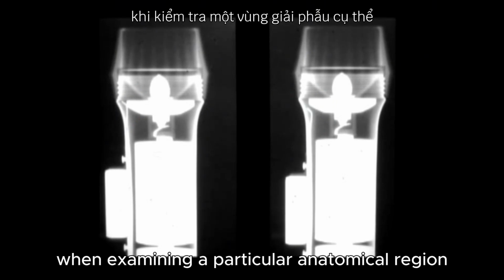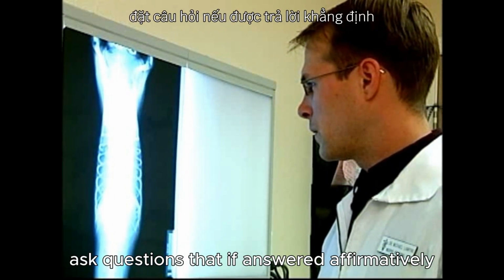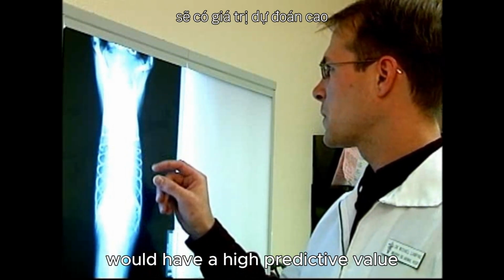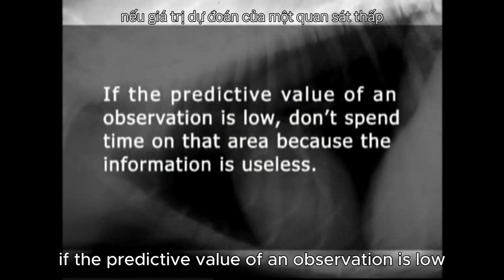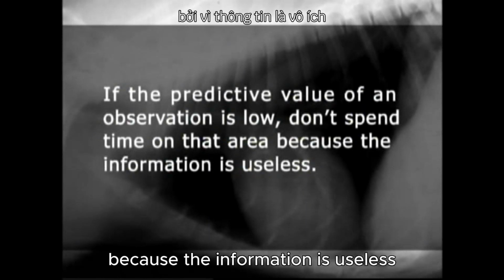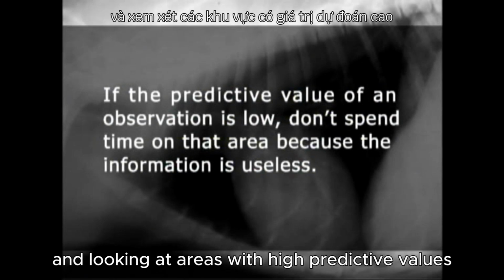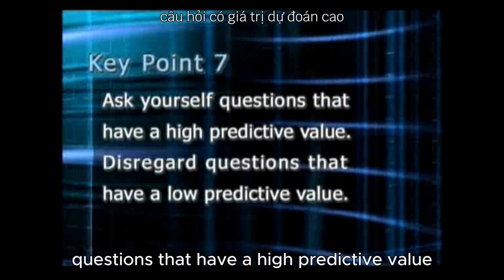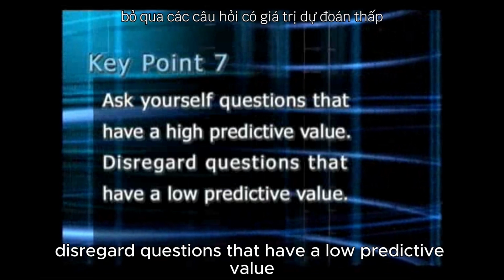When examining a particular anatomical region on a radiograph, simultaneously ask questions that, if answered affirmatively, would have a high predictive value for a particular disease or condition. If the predictive value of an observation is low, don't spend time on that area because the information is useless. Instead, stay focused on asking questions and looking at areas with high predictive values. Key point 7. Ask yourself questions that have a high predictive value. Disregard questions that have a low predictive value.